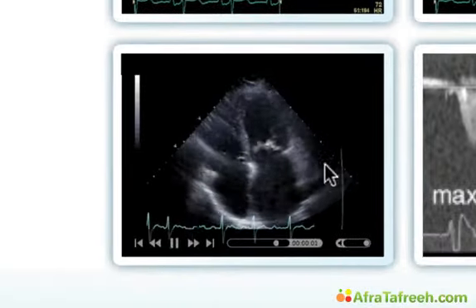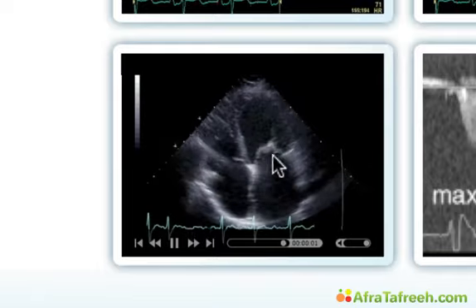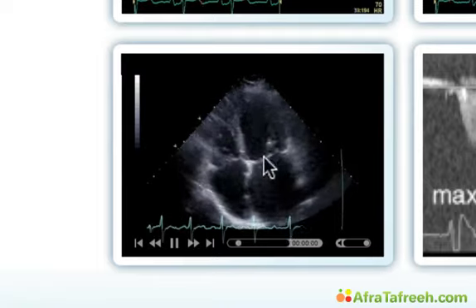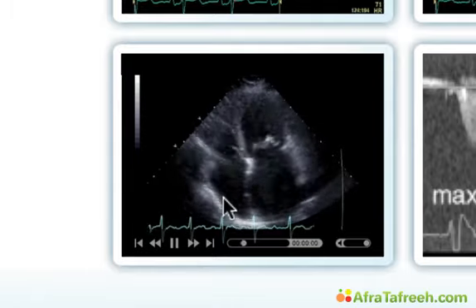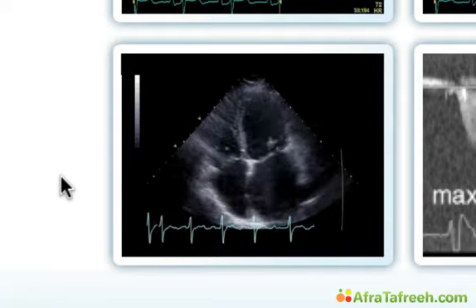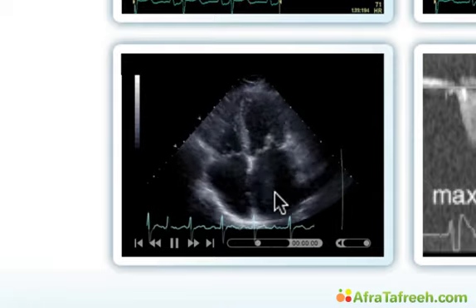Here's a patient with a very large atrium, again mitral stenosis, and also an enlarged right atrium. Take a look also at the shape of the atrium. It's more round, and we have a bulging of the interatrial septum to the right. We talked about that already when we talked about the heart chambers. This means that we have an elevation of left atrial pressure.